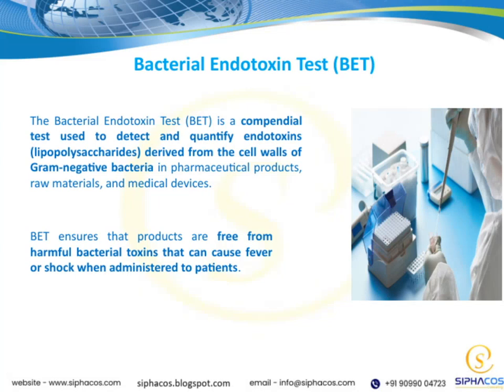Today, I want to highlight a critical aspect of product safety, ensuring that our products are free from harmful bacterial toxins. BET, or the Bacterial Endotoxin test, plays a key role here. It's a standardized or compendial test used to detect and measure endotoxins. These are lipopolysaccharides that come from the cell walls of gram-negative bacteria.